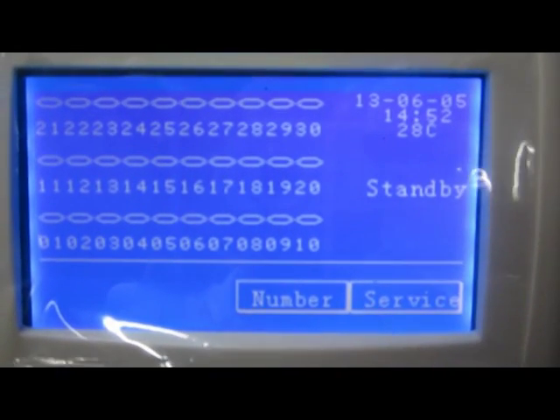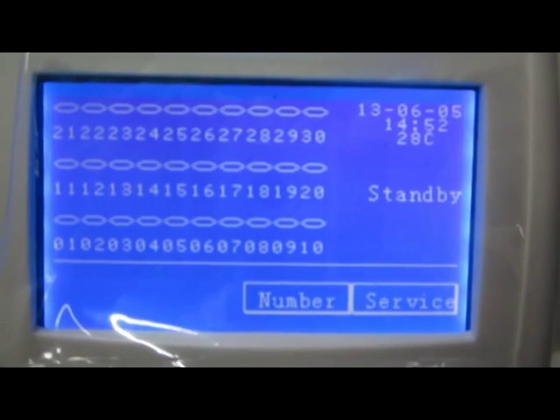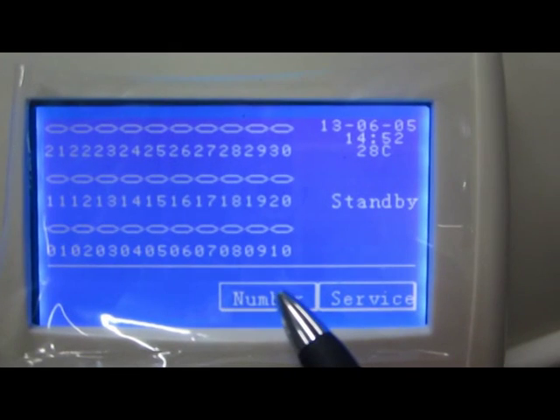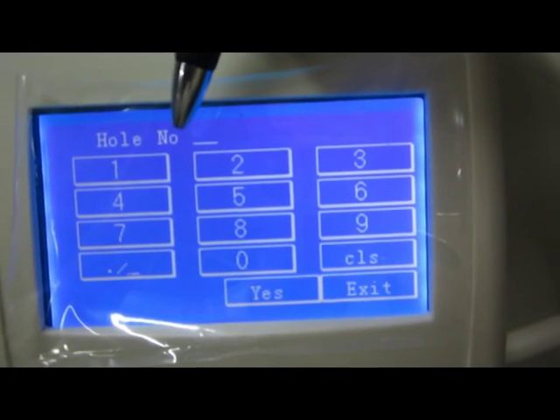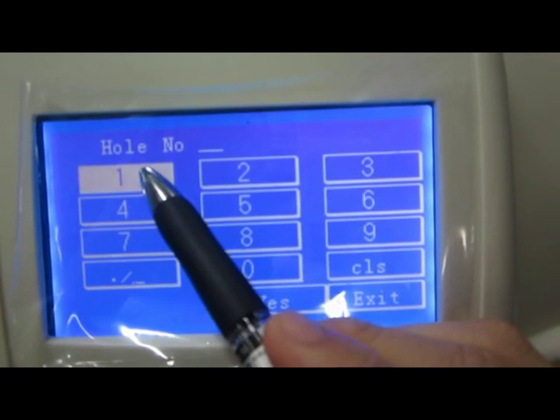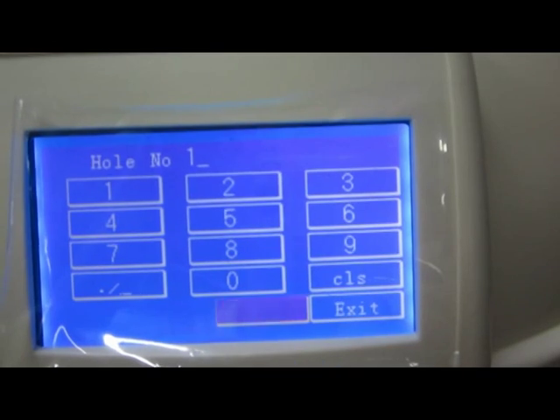Before the test, we have to program the device. First of all, we have to input two numbers. The first one is the hole number, and the second one is the patient number.